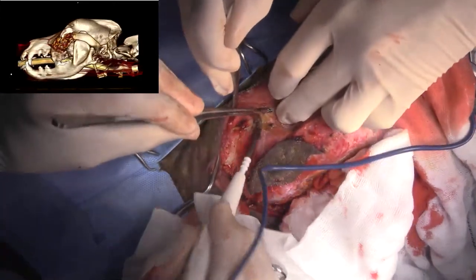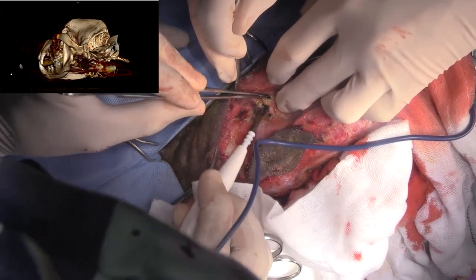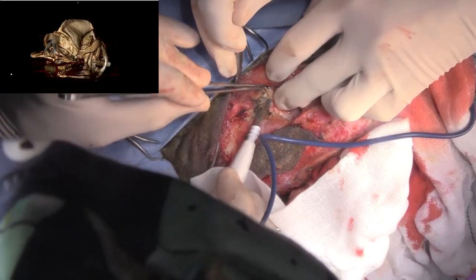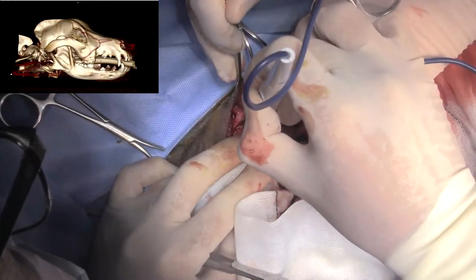All right, so that's the medial canthus right there. I'm just trying to expose the bone a little bit so I get a little better margin. This dog may have epiphora going forward because we probably are going to damage the nasolacrimal duct.